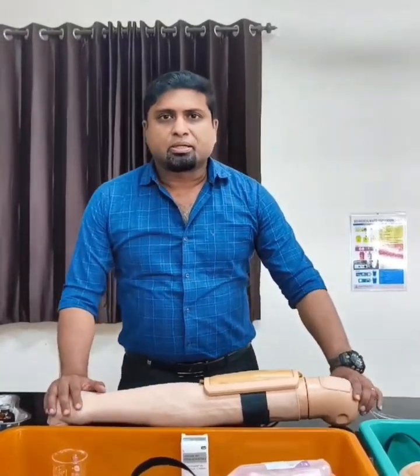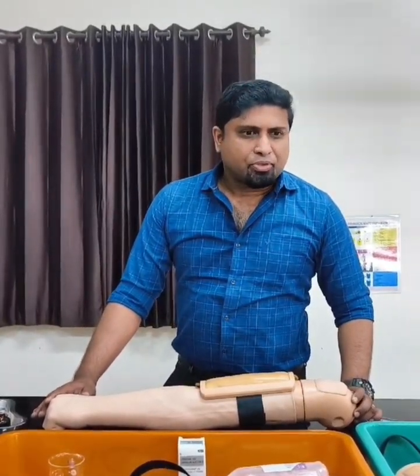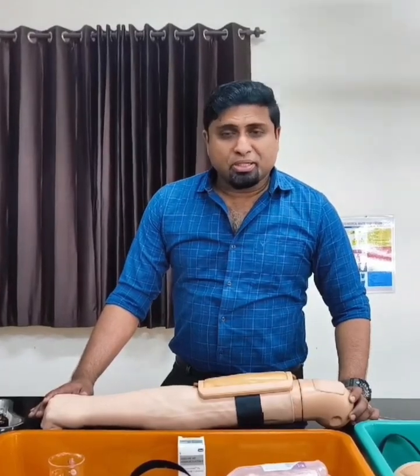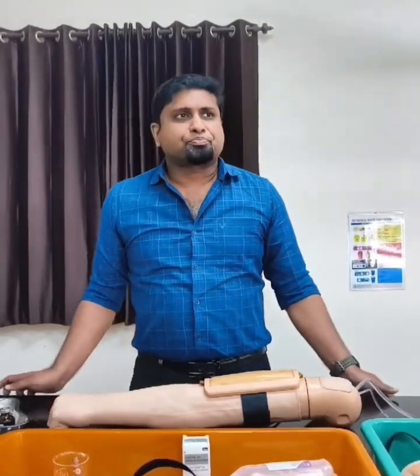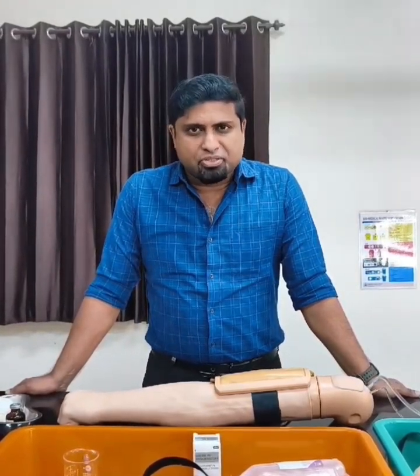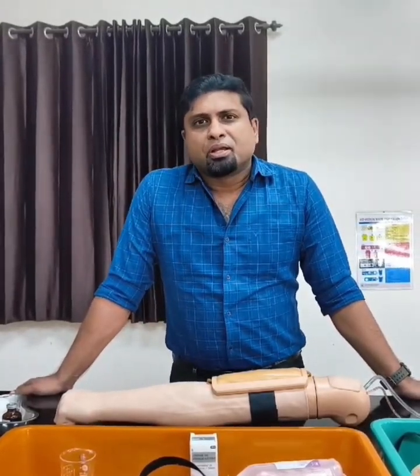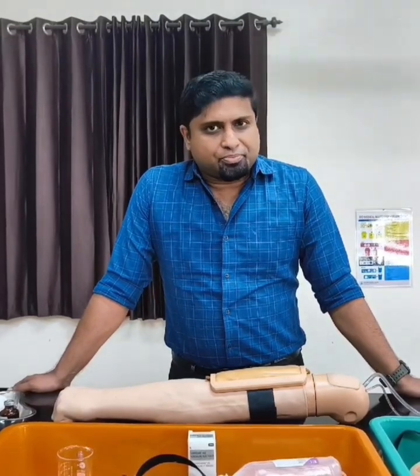Today we will try and see how we can administer a drug subcutaneously. One of the drugs which is given most commonly by the subcutaneous route is insulin. And it is important that we understand certain things before we actually administer insulin to the patient. Now, the first thing that we need to know regarding insulin is that it is available in different strengths.